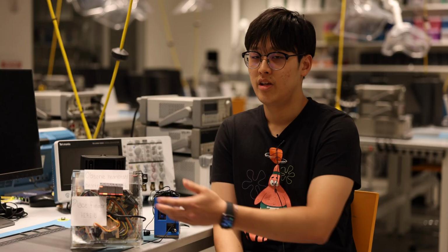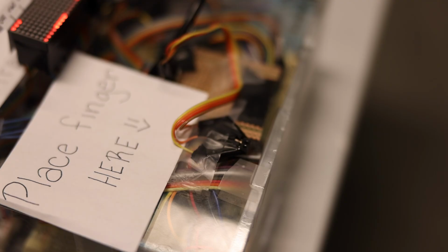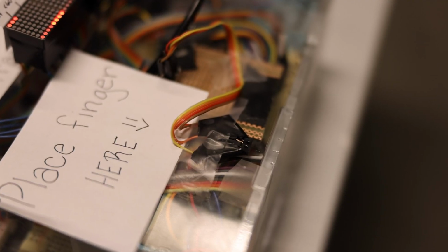Here's the machine. It uses a sensing and emitting photodiode to emit light into your finger and sense the light that is reflected back. The volume of the blood in your finger fluctuates slightly with each heartbeat. This fluctuation causes a change in the amount of reflected infrared light, which is picked up by the photodiode sensor. We can use the signal to determine a pulse by filtering the signal with the proper conditions.